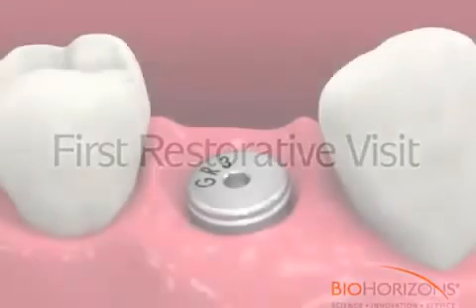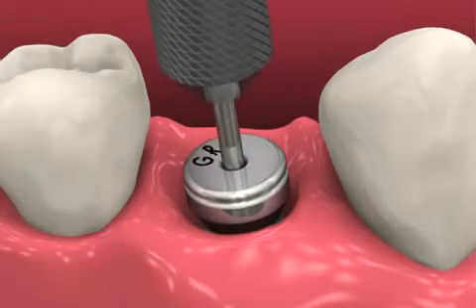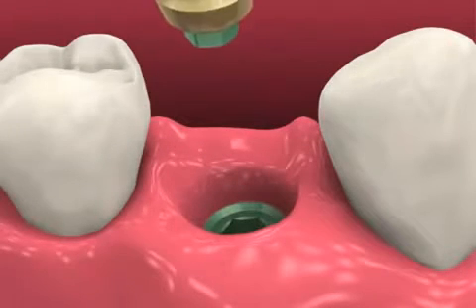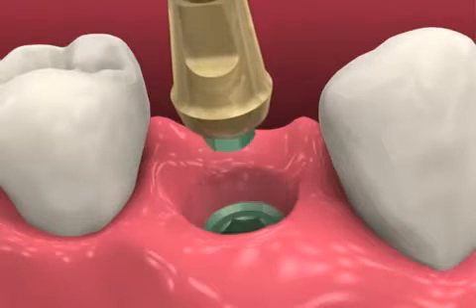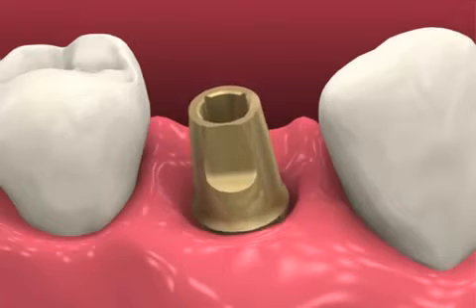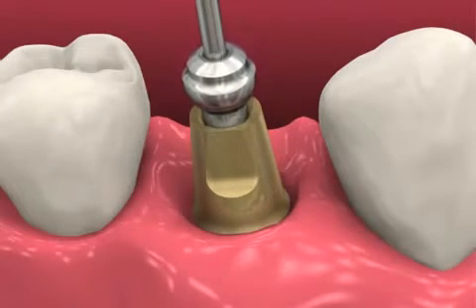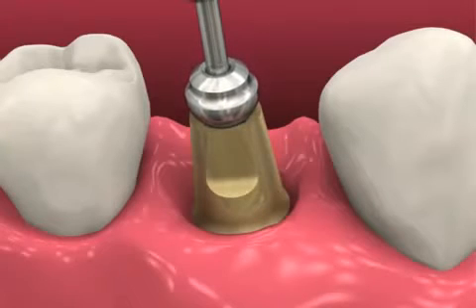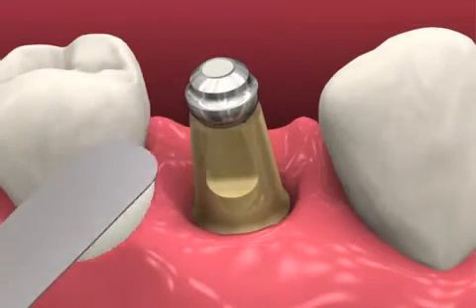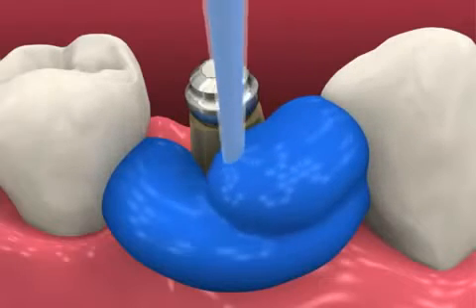At the first restorative visit, unscrew the healing abutment with an 050 hex driver. Irrigate the prosthetic platform to remove any debris and dry thoroughly. Seat the 3-in-1 abutment in the implant's hex — both the abutment and implant platform are color-coded to ensure proper component mating. Insert the ball top screw and finger tighten by hand or with the 050 hex driver. Radiographically verify complete abutment seating before making the impression.